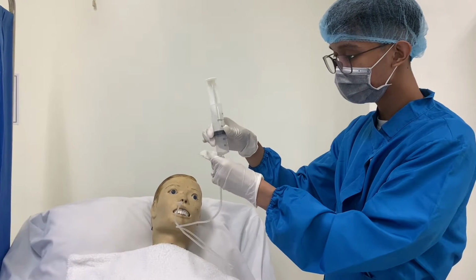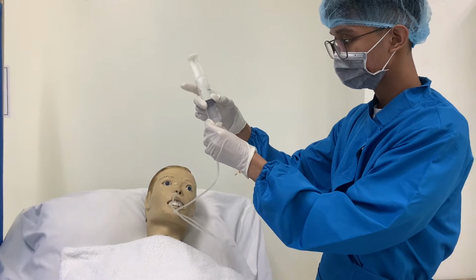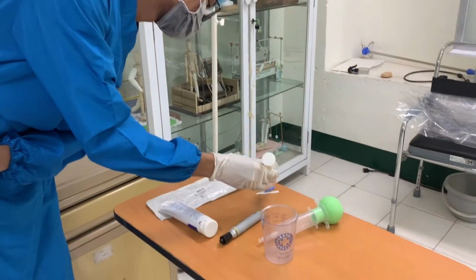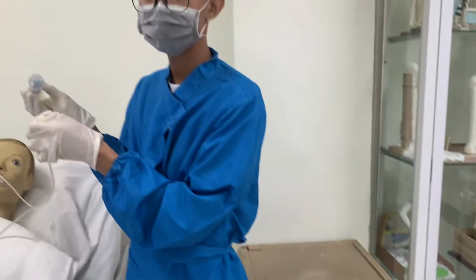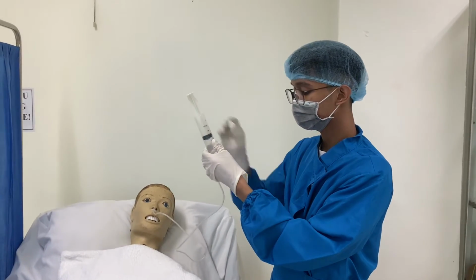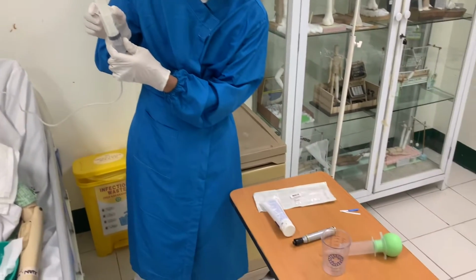Place a drop of gastric secretion onto the pH paper, or place a small amount in a plastic cup and dip the pH paper into it. Within 30 seconds, compare the color on the paper with the chart supplied by the manufacturer. Visualize the aspirated contents, checking for color and consistency. Obtain an X-ray of placement of the tube based on facility policy, as ordered by the physician.